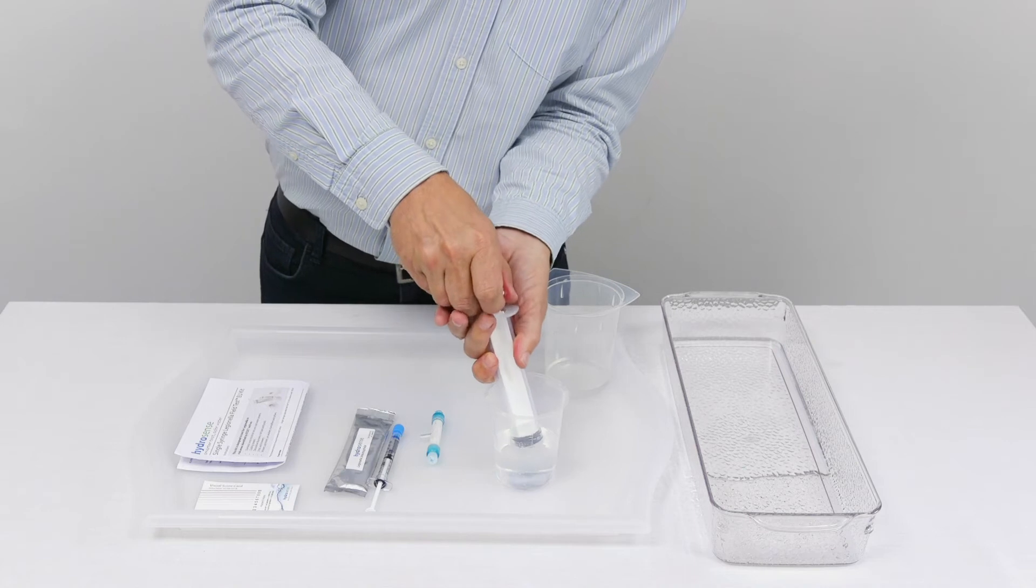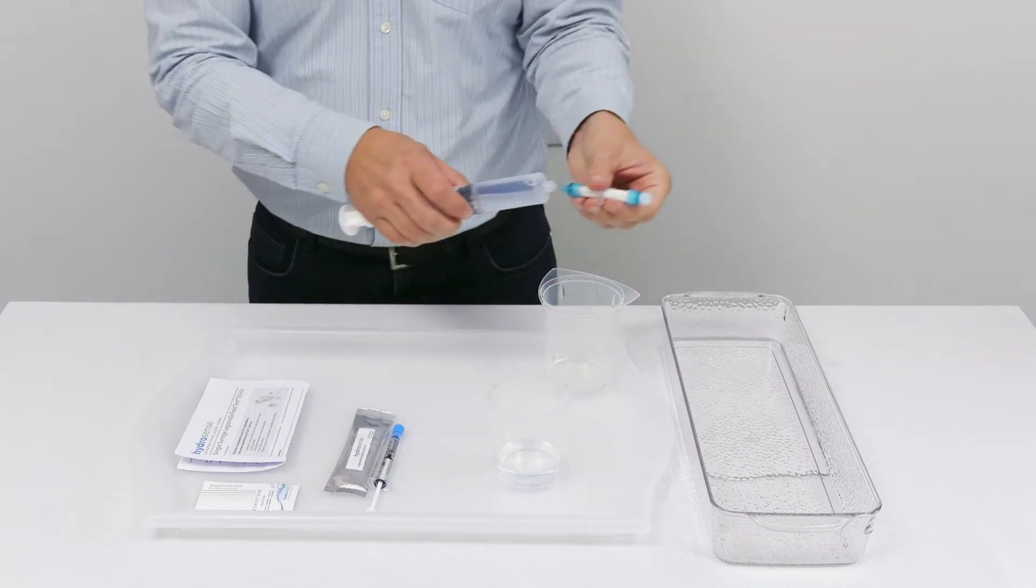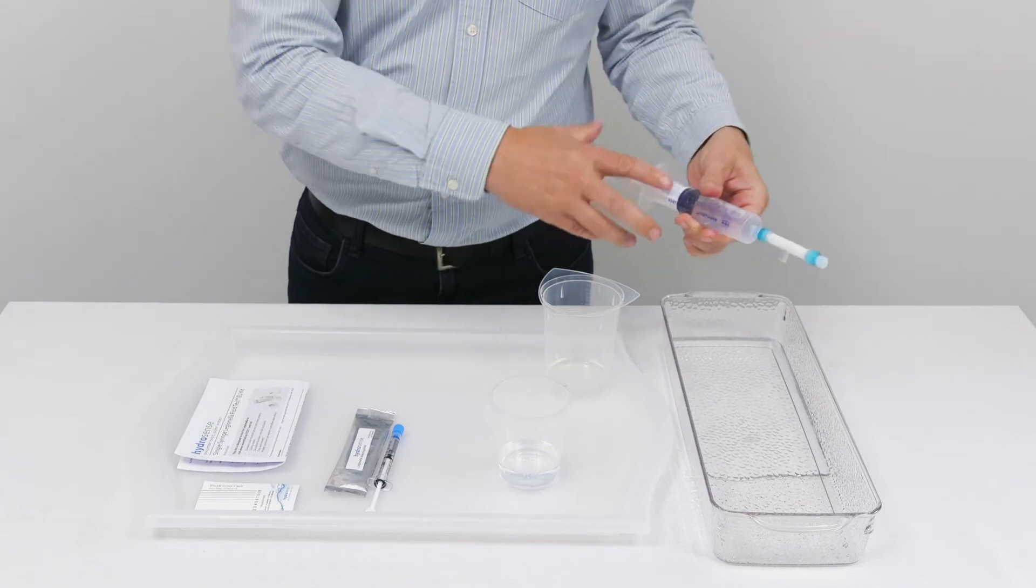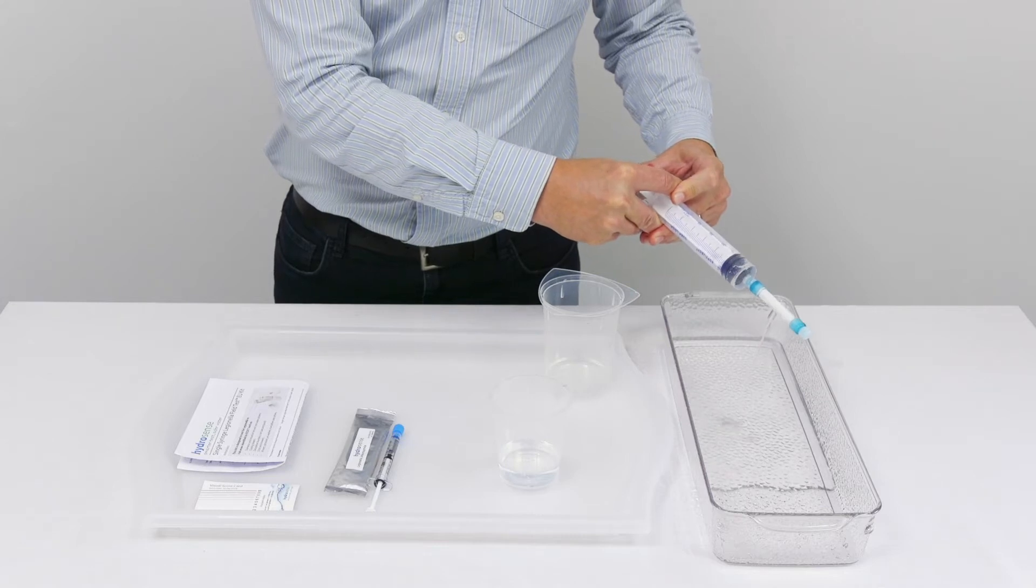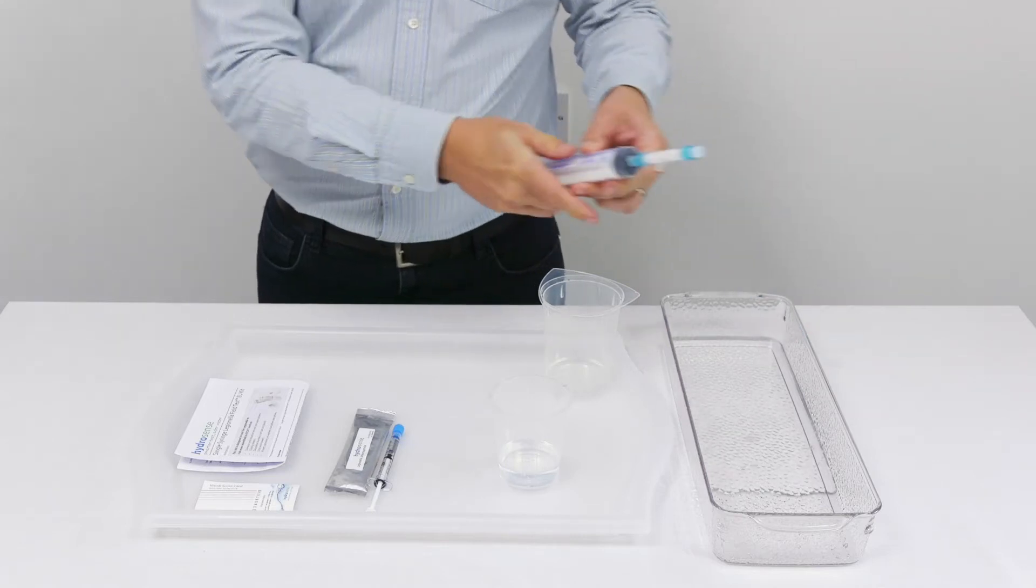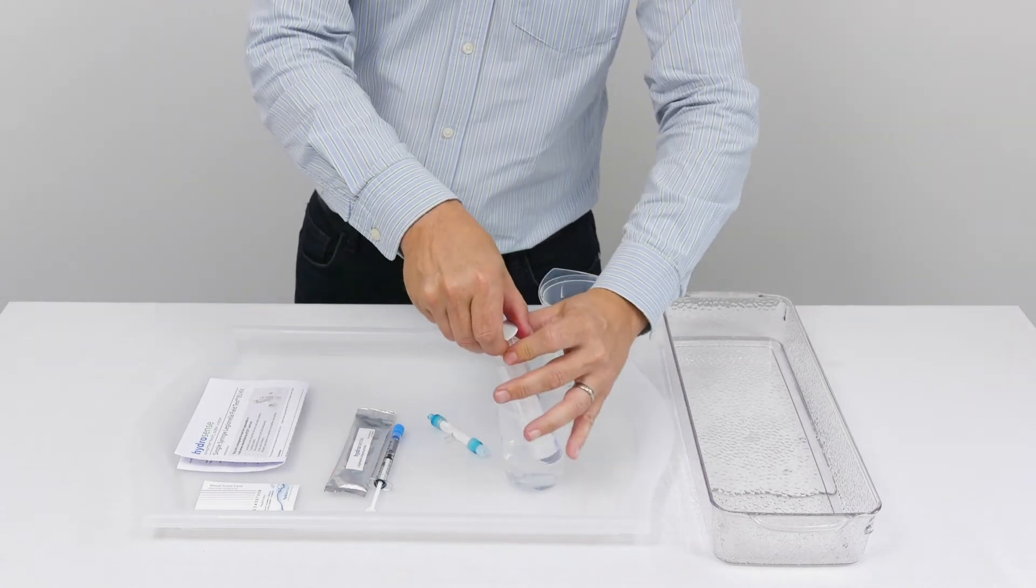Then we draw up the sample and attach it to the filter and pass the water through the filter. What we're doing at this point is concentrating any Legionella bacteria that are present in the water sample within the hollow fibers of the filter.